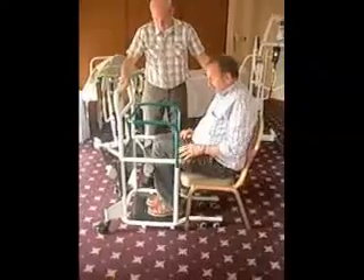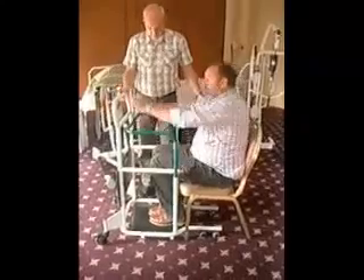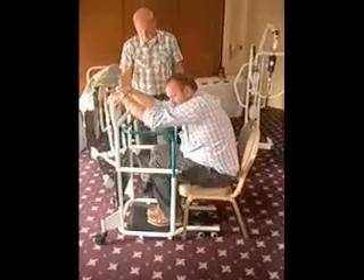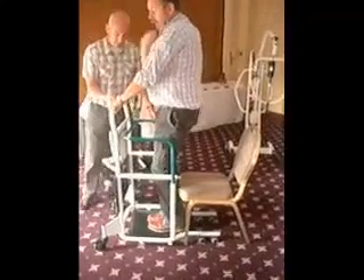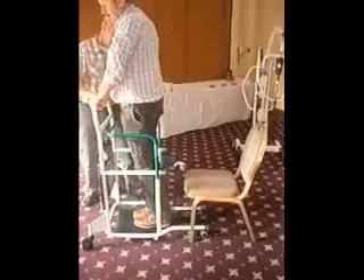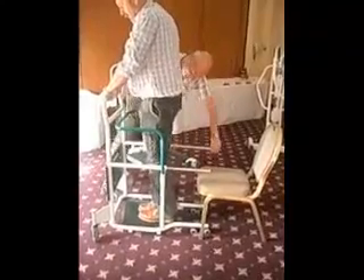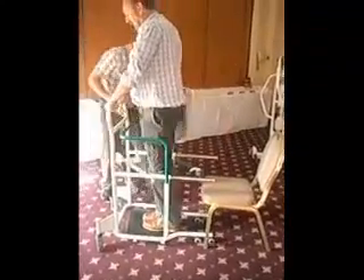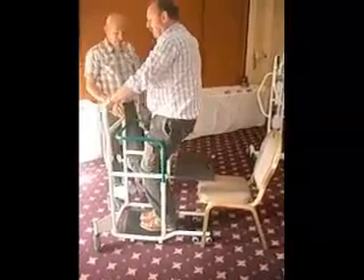Place the feet on the black space in the back, then go to the front as far as possible. This is the natural way of standing up — then you pull your knees, using shoulder strength and arm strength, and then Peter will bring the bars out very easily and ask me to sit down slowly.